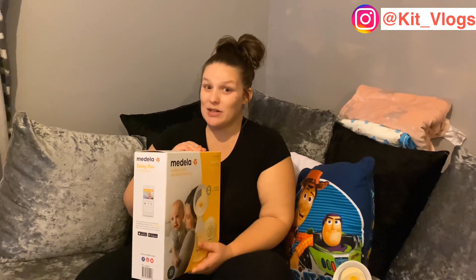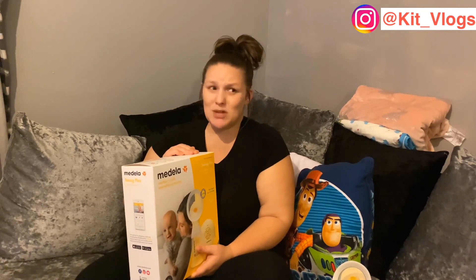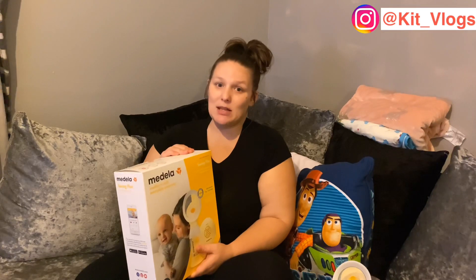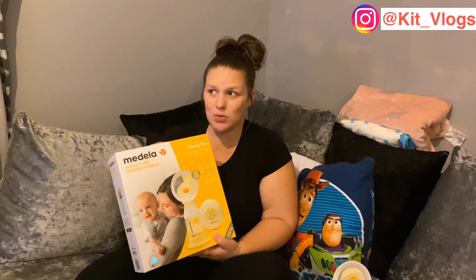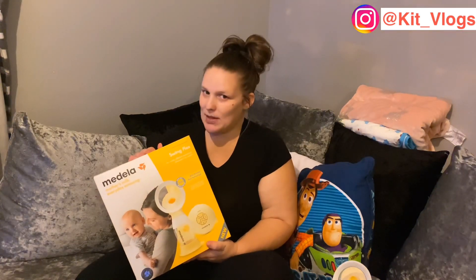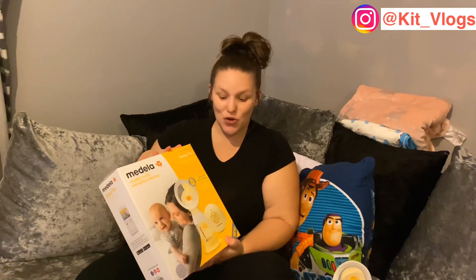I would definitely recommend it and there's nothing I could say that was bad about it, to be honest. It may be a bit expensive but it's worth investing in. Medela do some other breast pumps — the ones in hospitals are Medela Symphony ones, which are really expensive and out of my budget — but yeah, it comes with all the instructions and everything you need to get started.